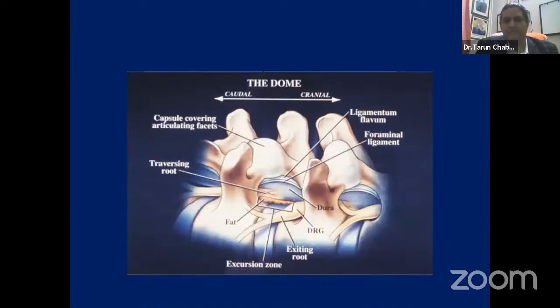So this is the last image of my talk. This speaks everything. This anatomy should be there in the mind of a young budding surgeon, and he will have no problem. If anything happens, you again check the anatomy, where you are, you see the C-arm, you visualize in the scope, and then proceed.